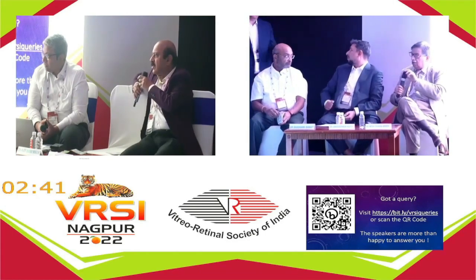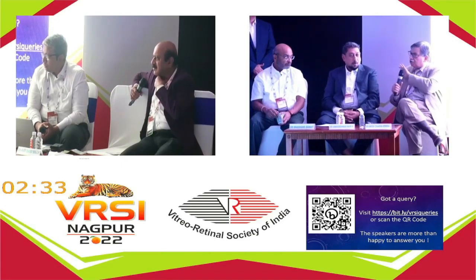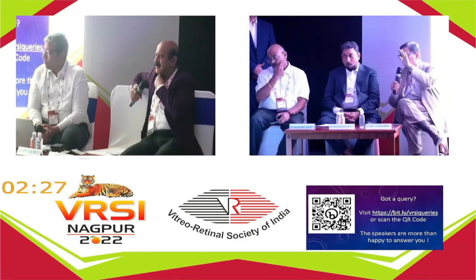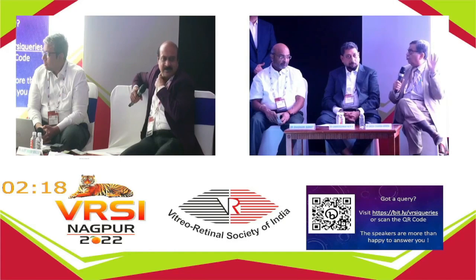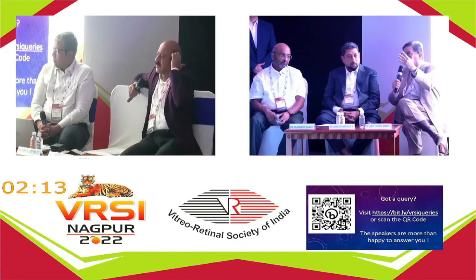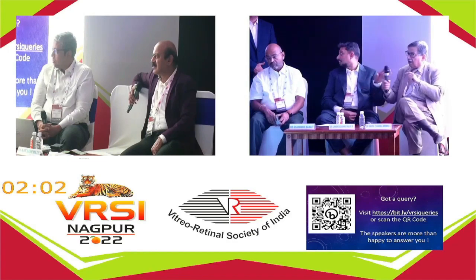Which do you like, true color or multicolor? I think that question is not being answered by either of you. Multicolor has the advantage of having those different reflectances, which give you different parameters. So what I want to know is, if I have to see a picture, should I prefer to see it as a multicolor image, or should I have a camera, same view, same everything? No, so multicolor does give you better.